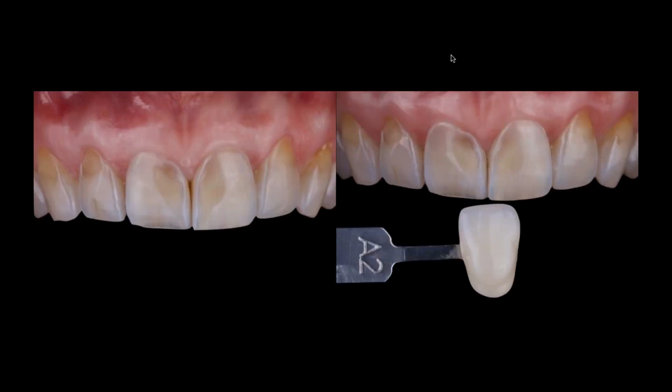So it makes it more challenging actually when you are going to focus on a limited number of restorations, and that's basically a reality day to day. Many times the patient is looking for 6 anteriors to improve that segment of their smile, and we really need to try to blend to the remaining teeth, but trying to improve regarding shape, regarding texture, and of course shade as well.